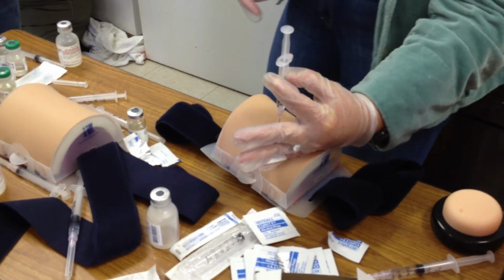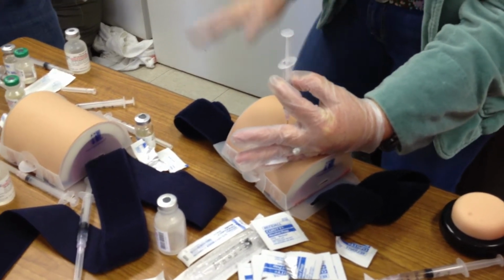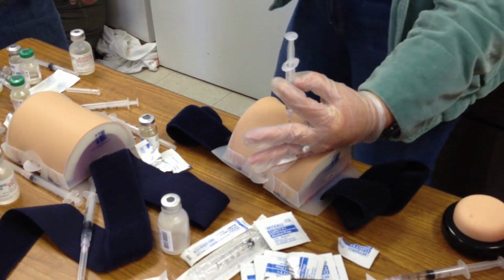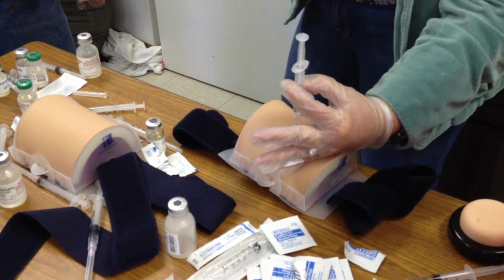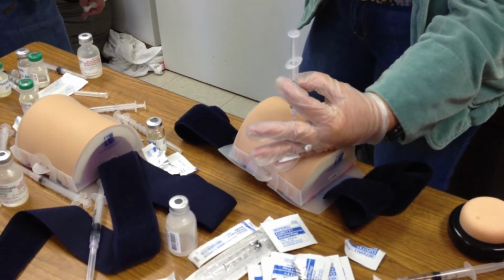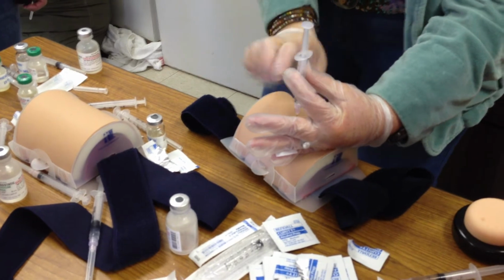And you never push... Oh, sorry. Go ahead. You never push the needle all the way in the... You can. If I were to have been a little more aggressive, I would have buried it all the way to the hub. There is no need to do that, however, if I had picked the right length of needle. It's okay that I have a little needle left out. Now, it's also okay to go into the hub. Let's say this was a very large patient, and I knew that I had plenty of extra needle to go. I would just gauge how hard I did that based on the patient. So the proper length of needle is very important, because you don't want to have to bury it up to the hub in order to get to the muscle. You'd want to choose a half inch longer needle to give you that latitude of not having that much in.